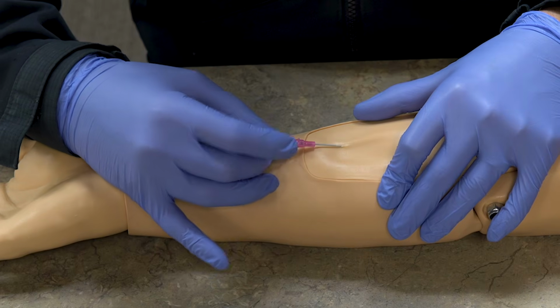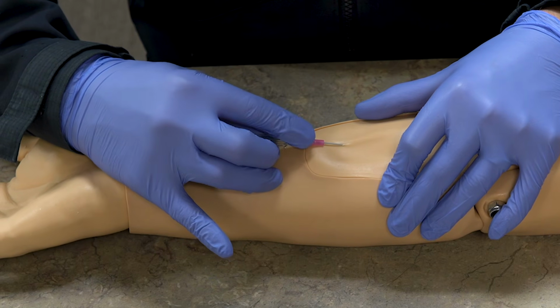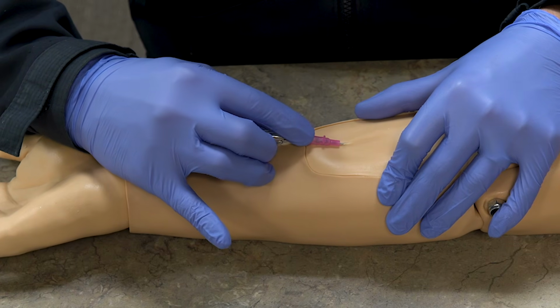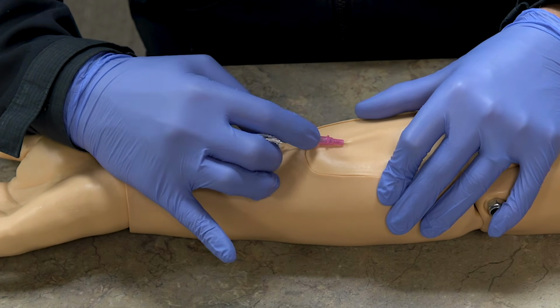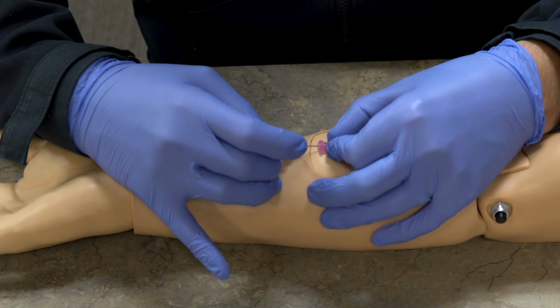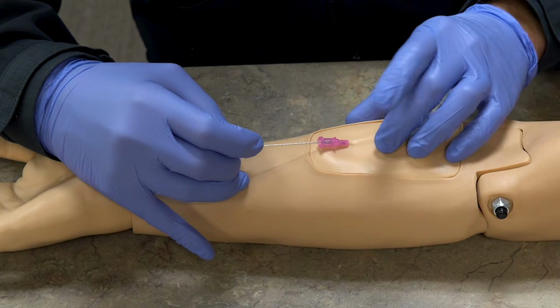Once you've advanced that, you can take your pointer finger and you can advance the plastic catheter into the arm. Now this mannequin's a little bit challenging, so you can advance that in while you're pulling the needle out. You can also do it with your other hand. You can push the catheter into the vein. And then you remove the needle, and you want to be really careful in removing the needle.